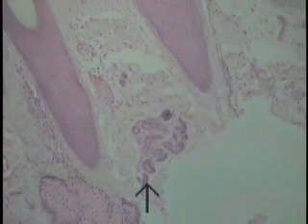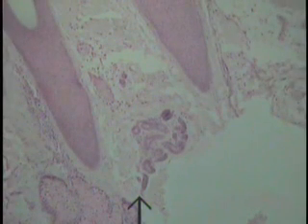Having found and examined an example of stratified columnar, return to the section of thin skin in an attempt to identify a sweat gland, an eccrine sweat gland, one of the locations where one can observe stratified cuboidal type of epithelium. Leaving the epithelial surface and going down into the interior of the tissue, look for simple tubular glands.